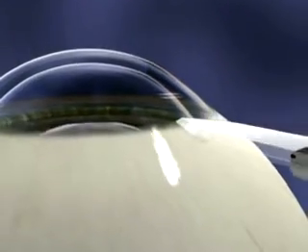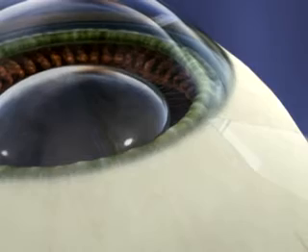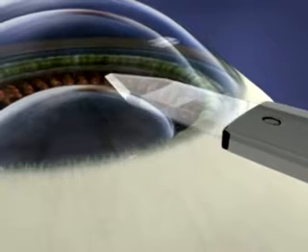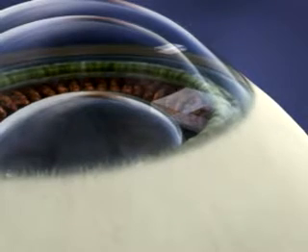When making the clear corneal incision, the temporal approach orients best to the iris plane — this prevents inadvertent touch of the crystalline lens. Using a knife you're comfortable with, make a slow and controlled entry. The clear corneal incision should have a cord length of 3 to 3.2 millimeters, with a 2 millimeter tunnel on a parallel plane to the iris.